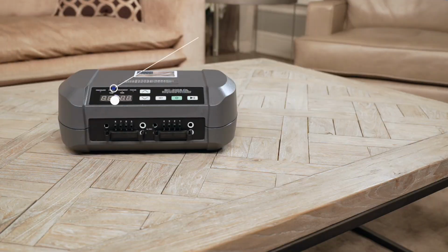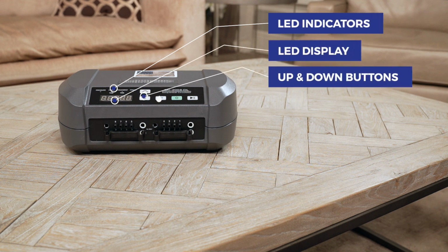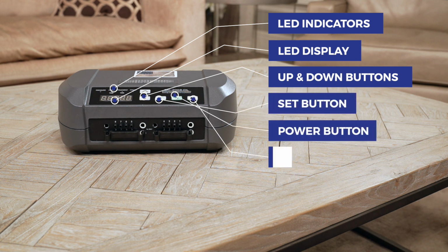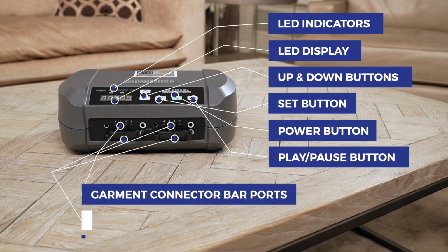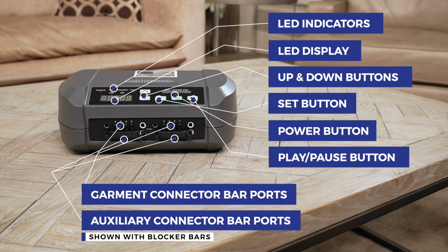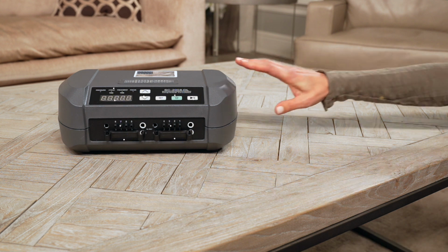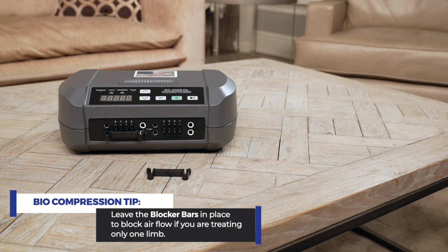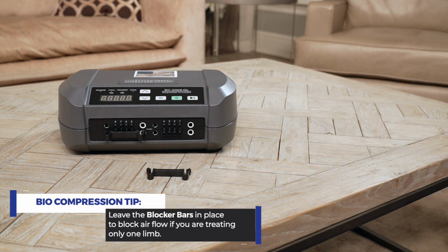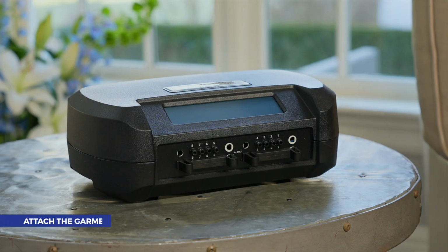These sequential circulators have LED indicators, LED display, up button, down button, set button, power button, play pause button, garment connector bar ports, auxiliary connector bar ports shown with blocker bars. Leave the blocker bars in place to block airflow if you are treating only one limb. If you are treating 2 limbs, you won't need the blocker bars, but you should store them safely for future use. Now it's time to attach the garments.